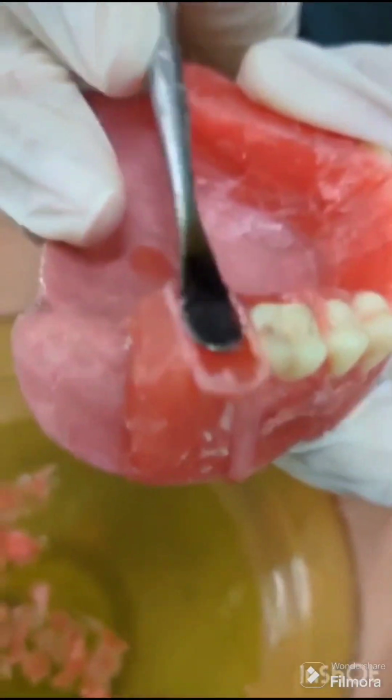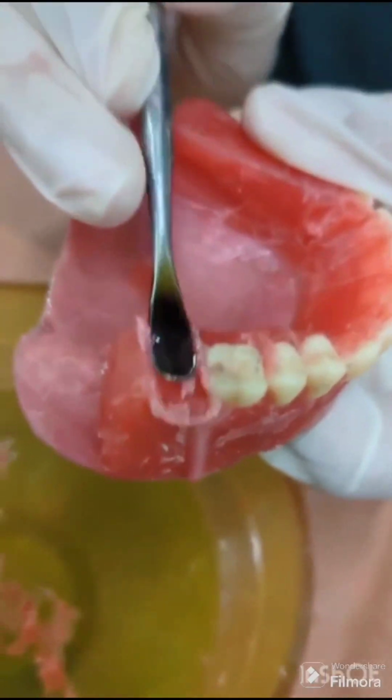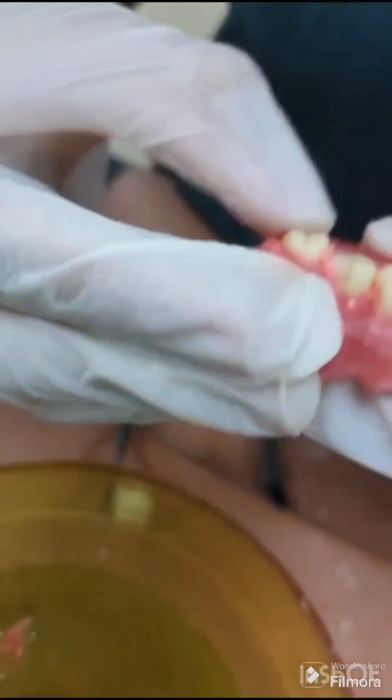Next, arrangement of the maxillary second molar. When viewed from the front, it slopes more buccally than the first molar. When viewed from the side, it slopes more distally than the first molar.